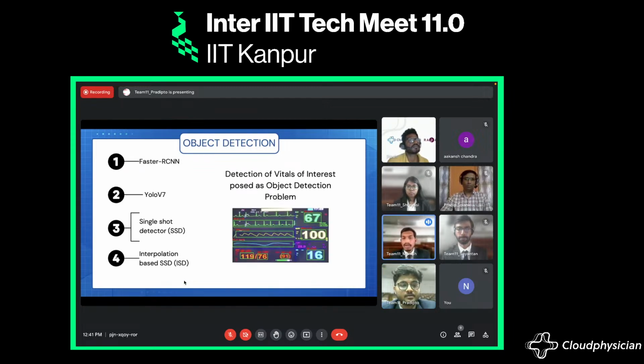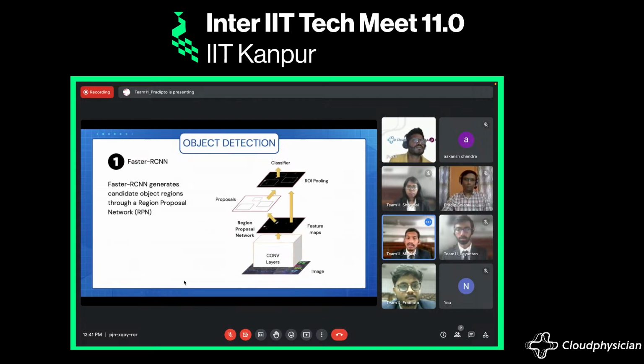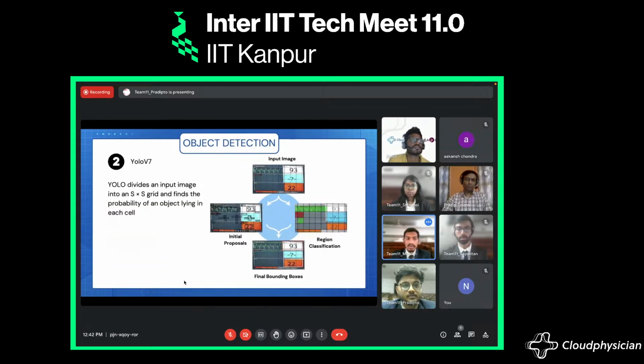After we have segmented the monitor screen from the image, we perform the task of object detection to extract the bounding box of the vitals as shown. In our experimentation, we tried out various object detection methods, including both supervised and semi-supervised detection methods. Beginning with Faster RCNN, it is an object detection model that generates candidate region proposals with the help of a region proposal network. The region proposal network is trained to predict the objectness scores for each proposal, along with its bounding box coordinates. Next, we have the YOLO V7 model.